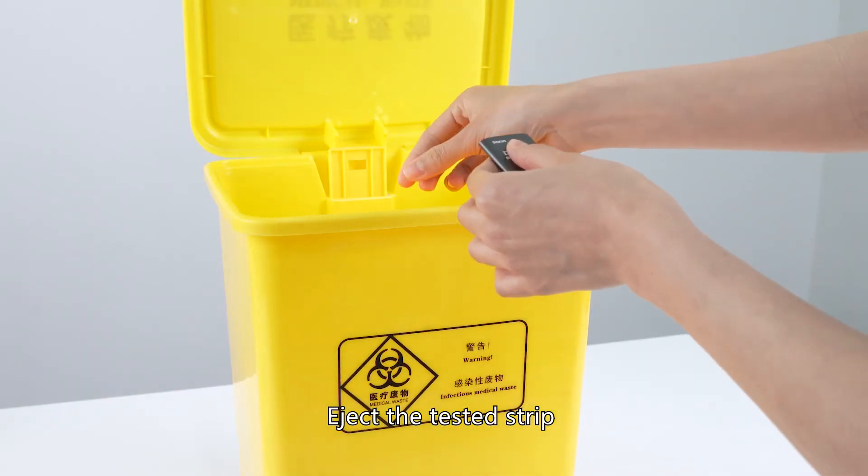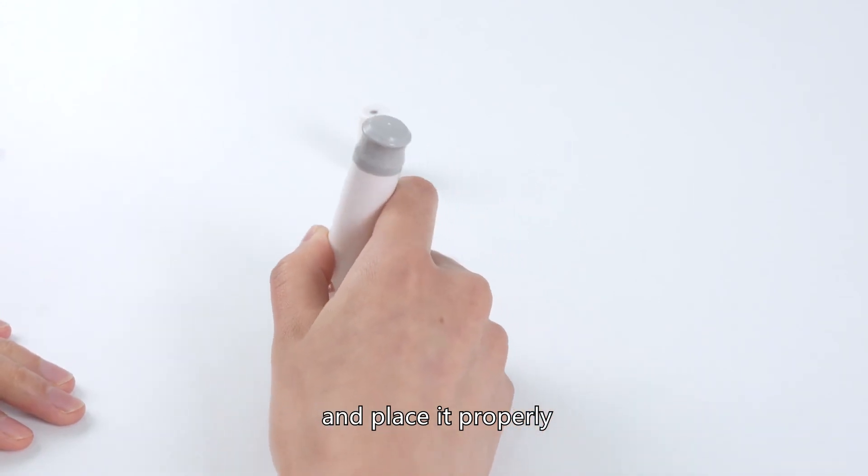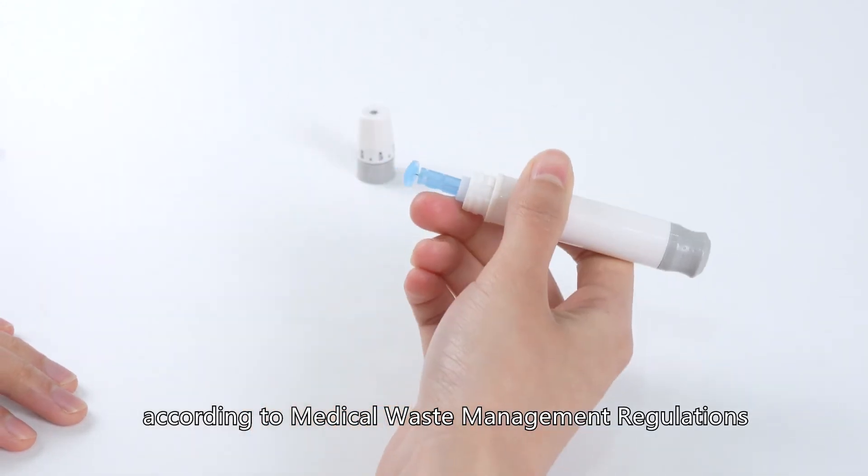Eject the tested strip, twist off the lancet, cover its cap, and place it properly according to medical waste management regulations.